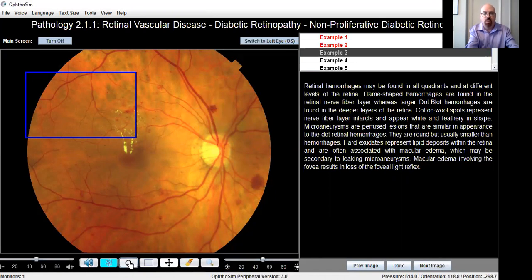And I'll show you once again. Click the circle, move to the center of what it is you want to highlight, left click, move it, and here I've drawn a wider circle. So obviously, the further you pull the extent of the circle, the larger it will grow concentrically. I'm going to go ahead and erase that and show you how to use the rectangle or square function.